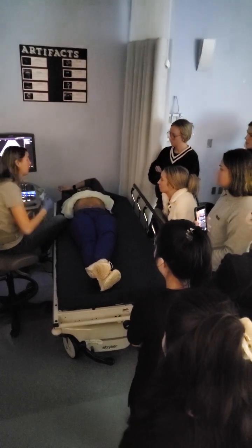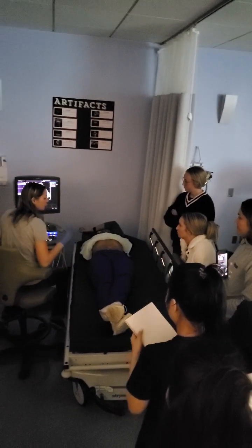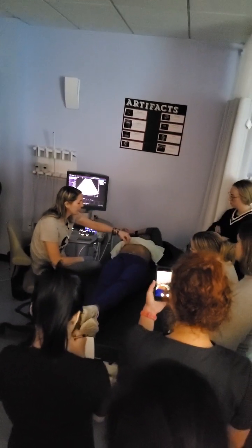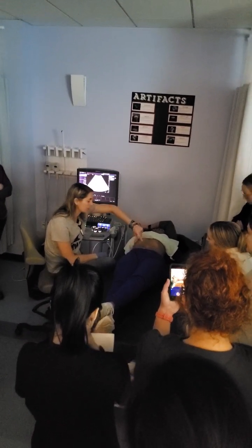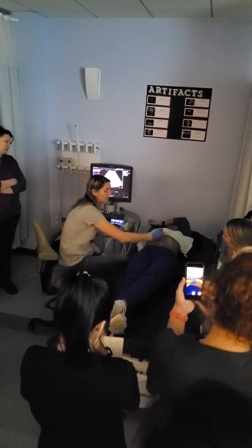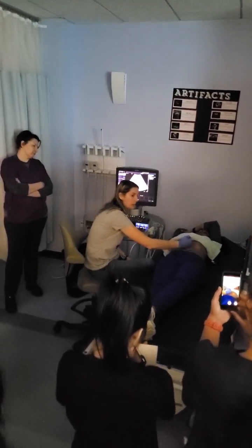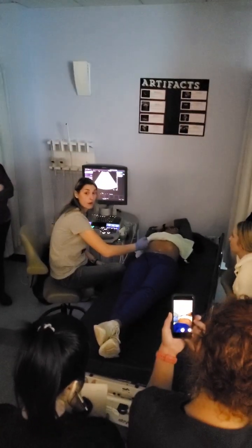Good luck. Okay, so as far as seeing that gallbladder goes, there's two ways that we can evaluate the gallbladder. If we think about it, it's attached with its neck, and it's kind of a pendulum that hangs down, so it can swing any way it wants. And it's attached to that right portal vein. So what I'll do is I'll come in sag, and then I'll follow that main portal vein all the way through the liver to the right portal vein and look for the main lobar fissure.